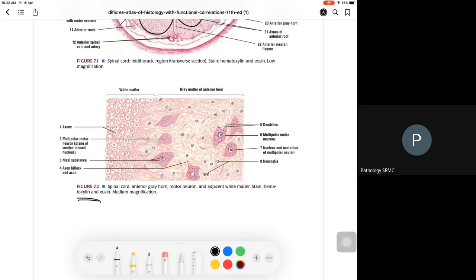Sir, the cell body is very large with abundant cytoplasm, and the nucleus is in a lower plane. No, the nucleus is in a plane that is not seen in this cut. Probably when you go deeper, the nucleus will start coming. Do you understand? It's like an egg yolk. You may not see the yolk when you cut the periphery of the egg, but the deeper you go, you start seeing the yolk of the egg, isn't it?